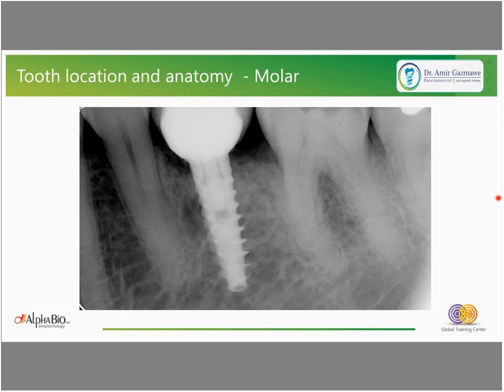This is the final result. We can see that we have a good emergence profile of the crown, and we have good stability and osseointegration of the implant.